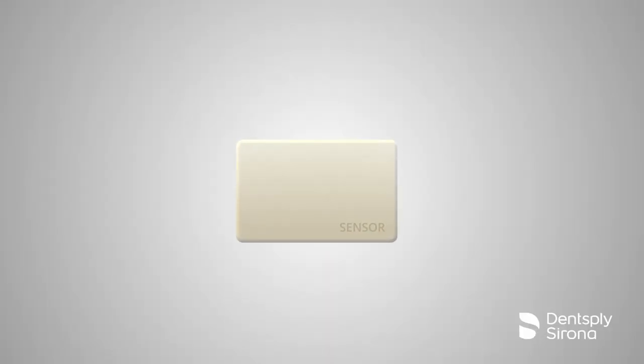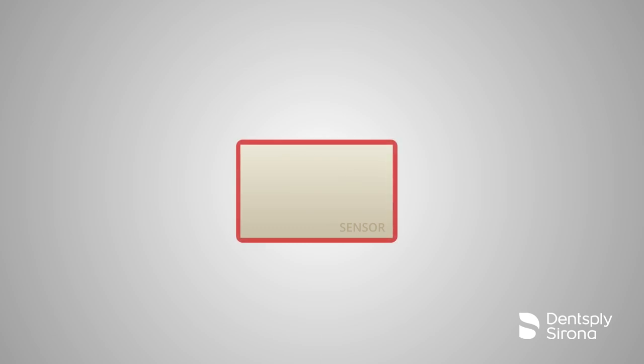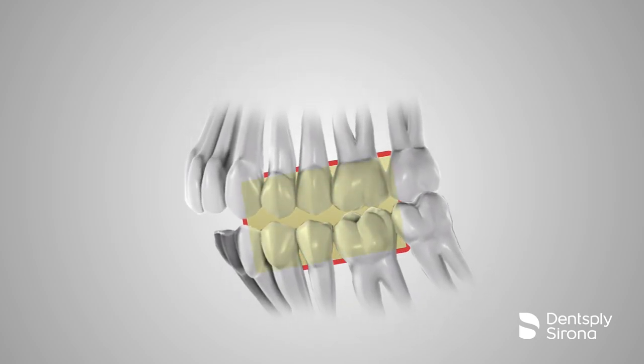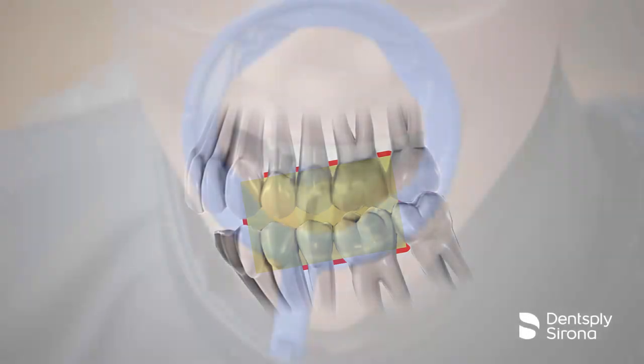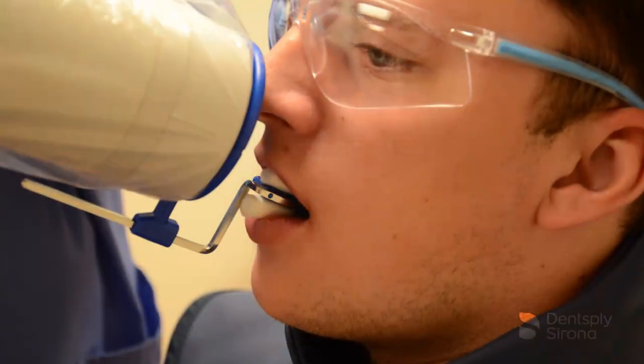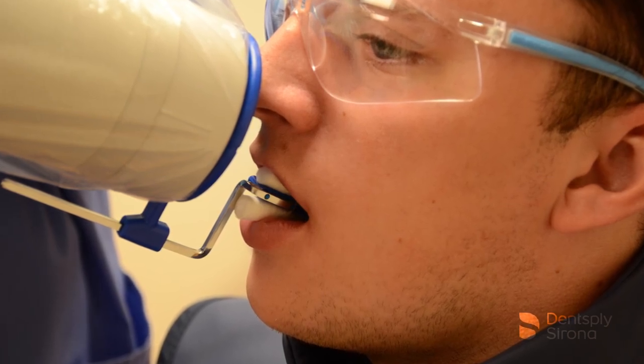It is important to keep in mind that all sensors have a certain parameter of inactive space. The clinician must compensate the sensor placement to ensure one is capturing the area desired. The image receptor should be placed as parallel as possible with the long axis of the tooth. Cotton rolls are often used during radiographic procedures to allow more comfort and assist in capturing necessary anatomy.